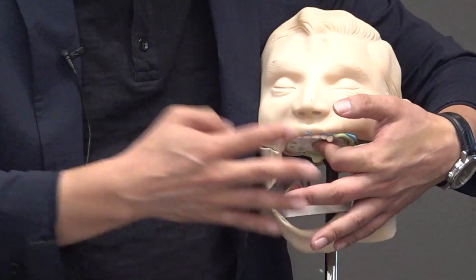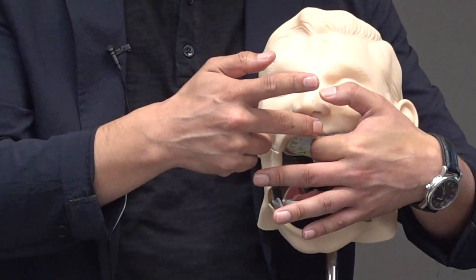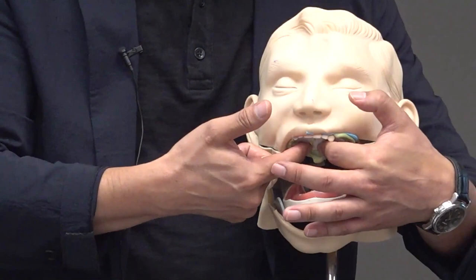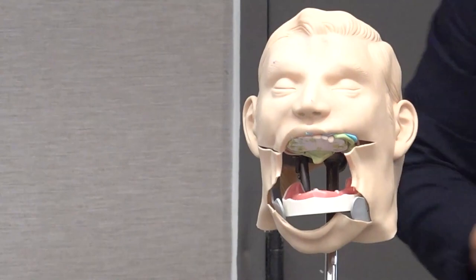So anyway, this patient is changed to a remaining-teeth patient. He has the anterior six teeth now. So I changed this patient to a partial denture patient, okay? Waiting for the hardening of the silicone, and then I prepare the lower. Before applying this one, I adjust this one simply.